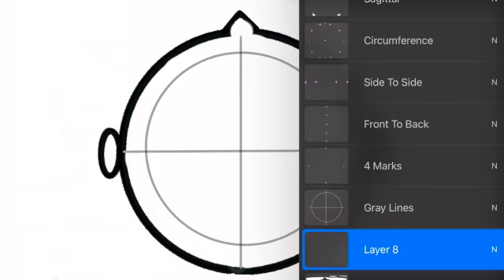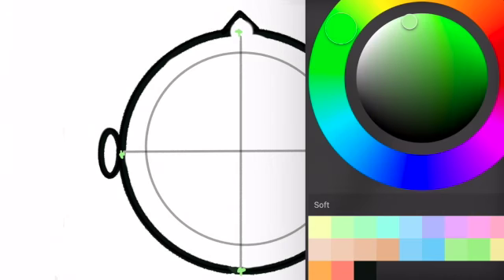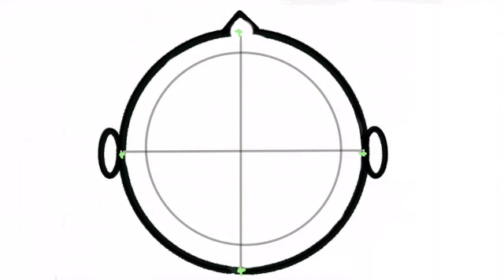Okay, so this video is going to be about the 10-20 placements. Starting off, we're going to mark the nasion, which is the top, like bridge of your nose, parallel to both your eyes. So I'm doing it right there. That's the nasion.